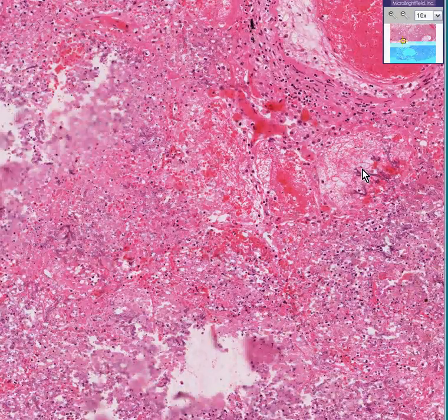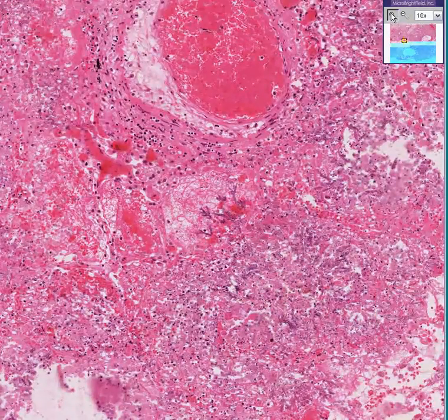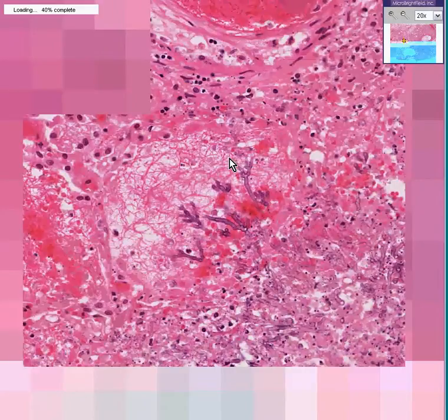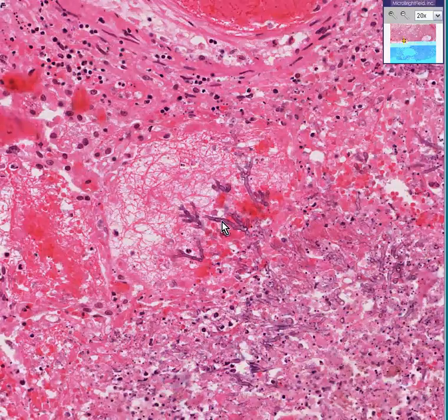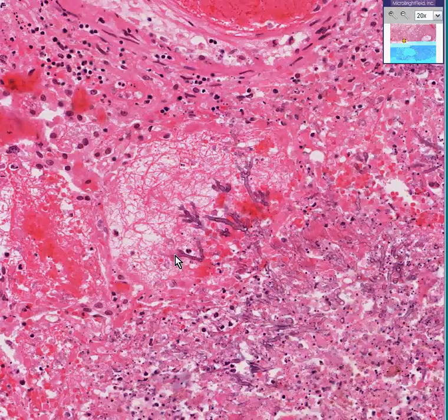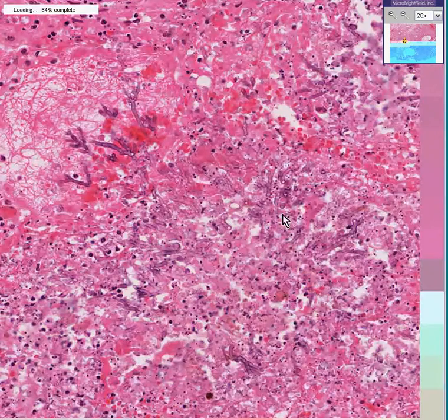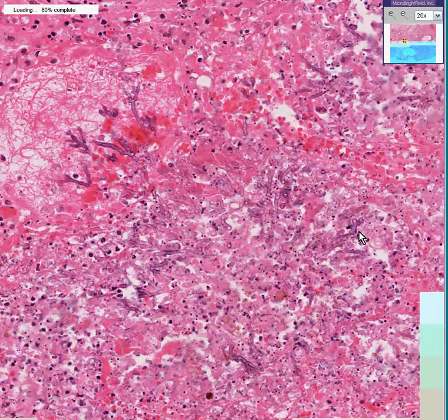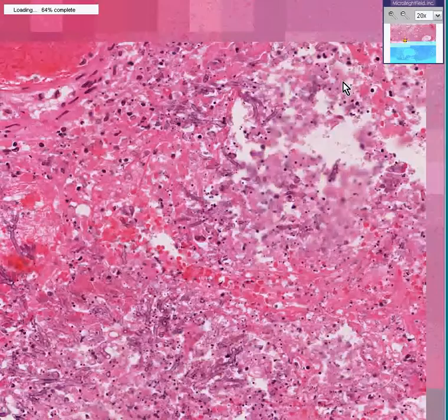Here's some fibrin, here's some blood, and here's an interesting little area — does it look like there may be little trees growing in there? Trees aren't supposed to infect lungs. Well, you can recognize quickly that this is our old friends the hyphae. You can see hyphae here, they may have little septums, and you can see that they branch. Over here, this whole area is loaded with a bunch of these little hair balls as well.